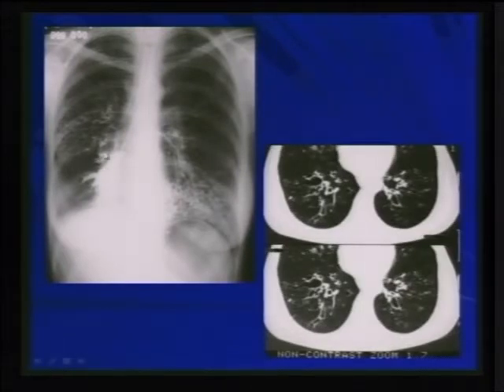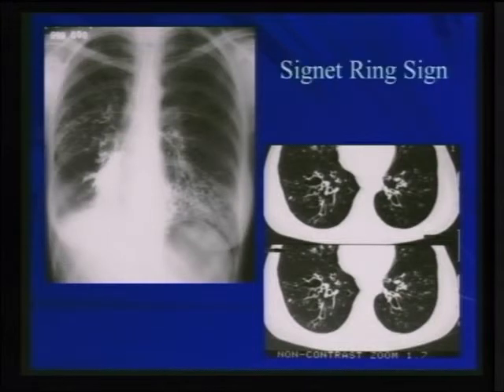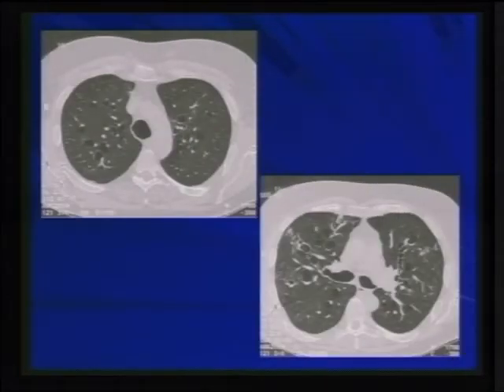And this is what I was alluding to. This is what we used to do. And I think I did one or two in my career, early in my career as a resident, almost 35 years ago. But very quickly, CT has replaced it. But this is what we call the bronchus sign, right? So this is the bronchus, and this is the accompanying artery. This has the signet ring sign. And again, this is your easy diagnosis of bronchiectasis, an area of decreased opacity, signet ring sign. Here's another patient with bronchiectasis. Again, you can see the medial distribution of the bronchi and the dilatation of the bronchi. Here's another case of Mounier-Kuhn, again showing the cystic bronchiectasis, but also the dilatation of the trachea and the bronchi.